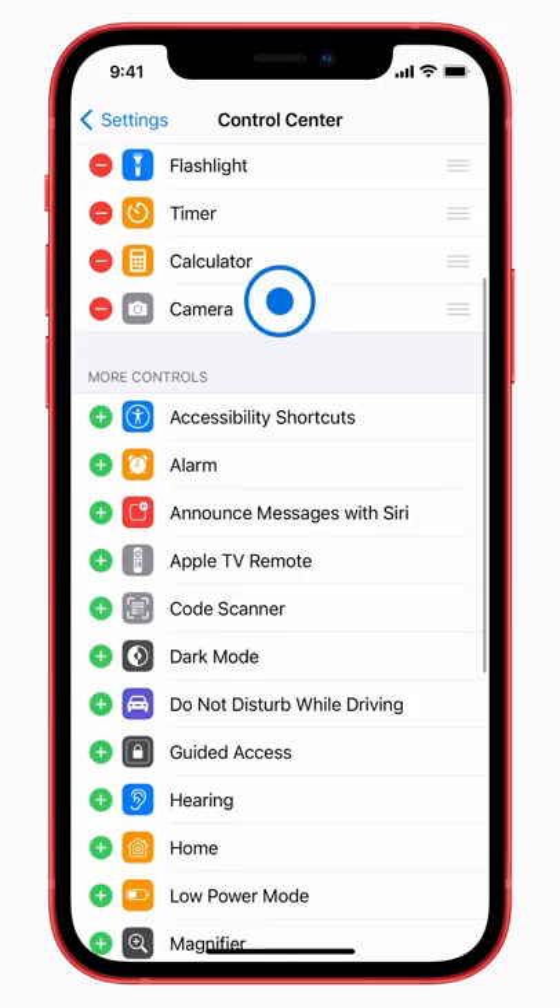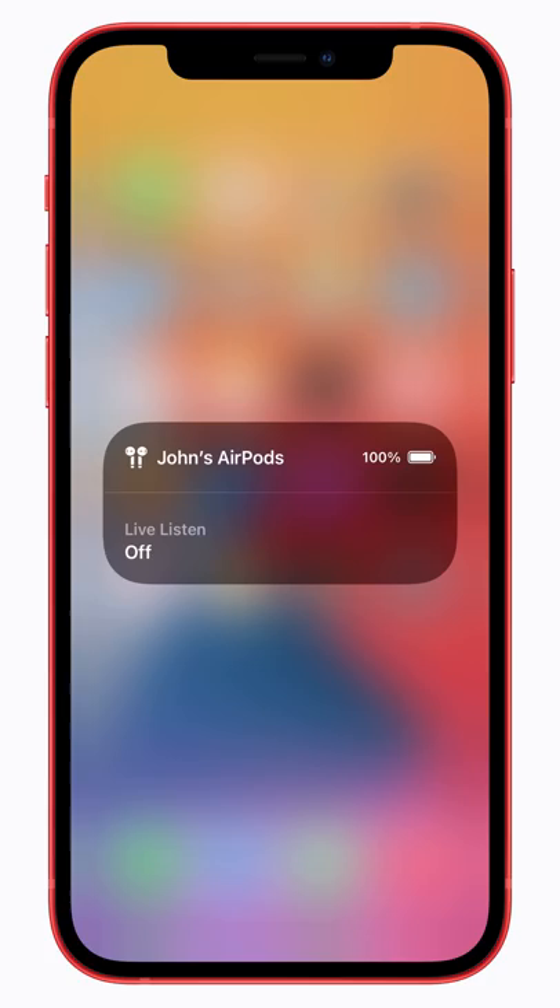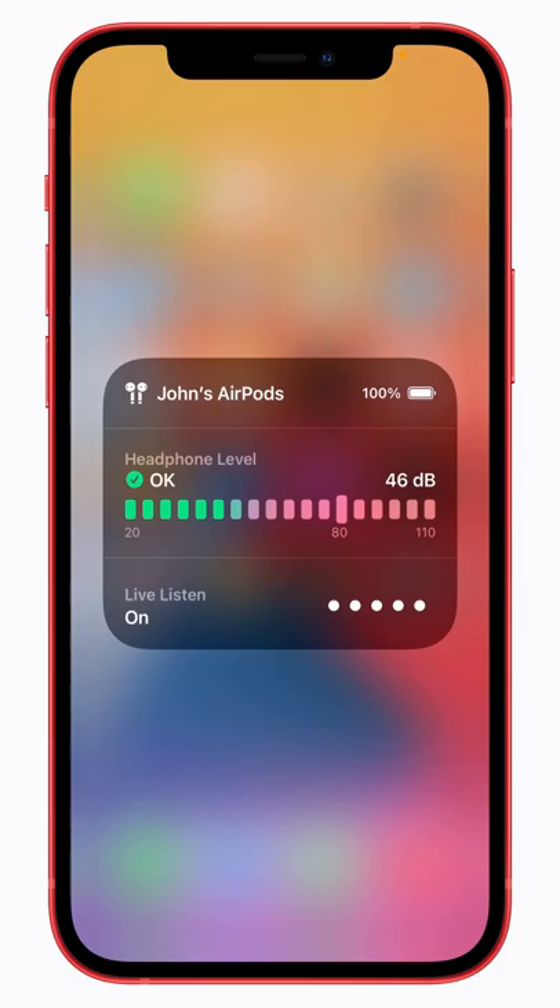To turn on Live Listen, open Control Center and tap the Hearing button. With your headphones connected, tap Live Listen to turn it on. Audio is sent from the microphone on your device to your headphones so you can hear more clearly.